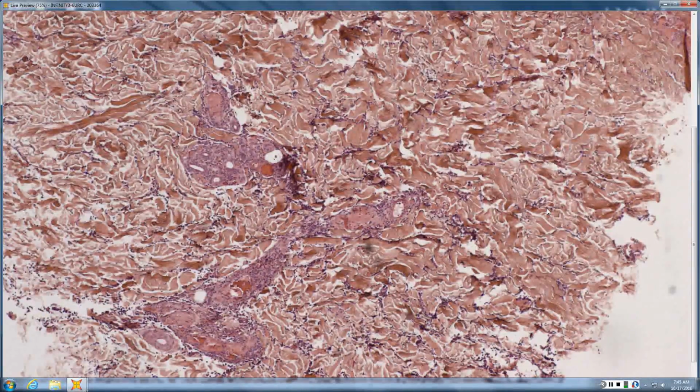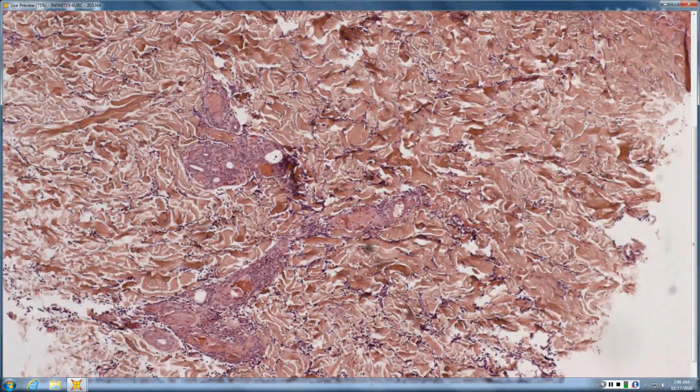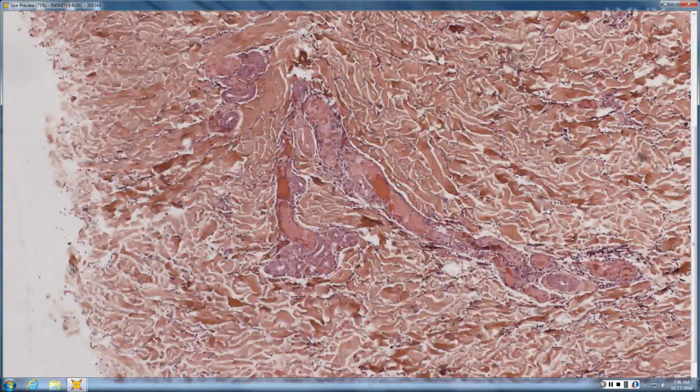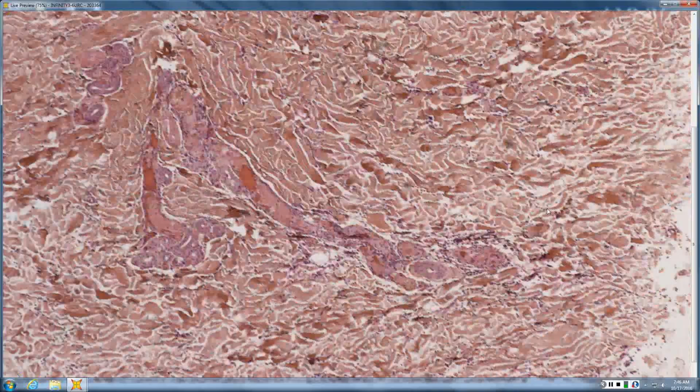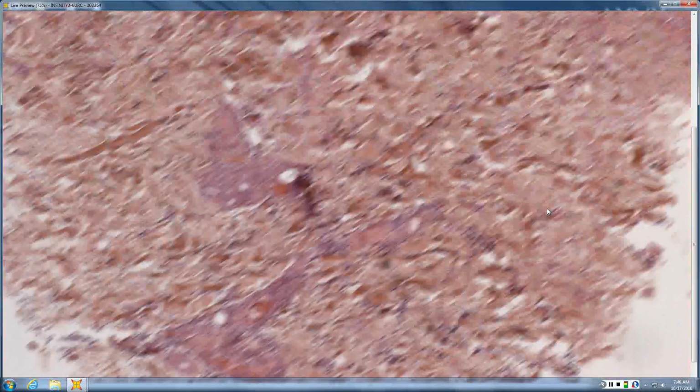Levamisole-induced purpura can be just thrombi or can be thrombi plus vasculitis. ANCA-associated vasculitis would be in your differential, especially Churg-Strauss with the eosinophils. What else can give you a little bit of vasculitis, wedge-shaped infiltrate, lots of thrombi, lots of eos? Give me an arthropod. Yeah. And this one was just a tick bite. So tick attachment site. But that was an excellent differential.